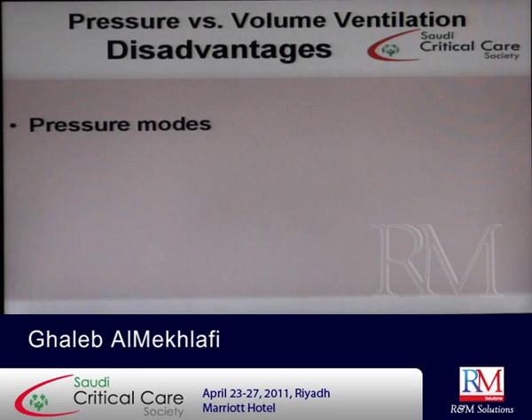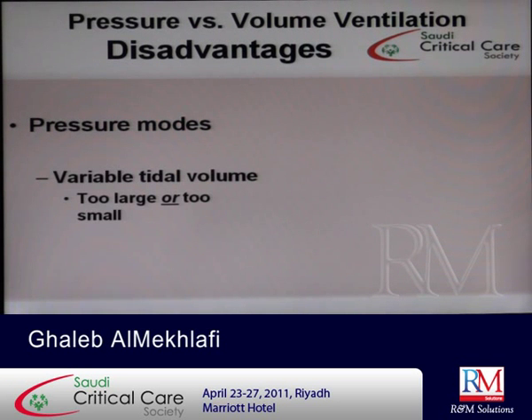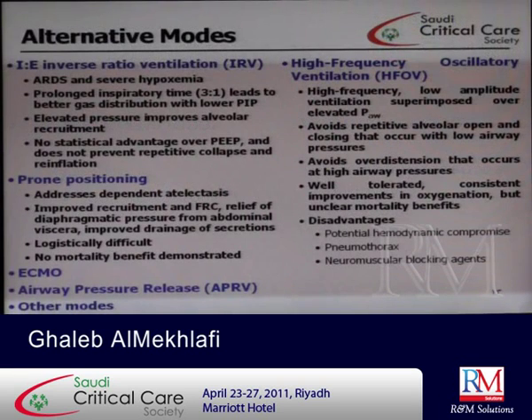I just talked about them. In pressure modes, there is variable tidal volume, either too large or too low, and you have to adjust the pressure until you reach that target volume. So continuously you have to monitor the volume in pressure modes, because the patient may go into hypoventilation or even hyperventilation. Okay.